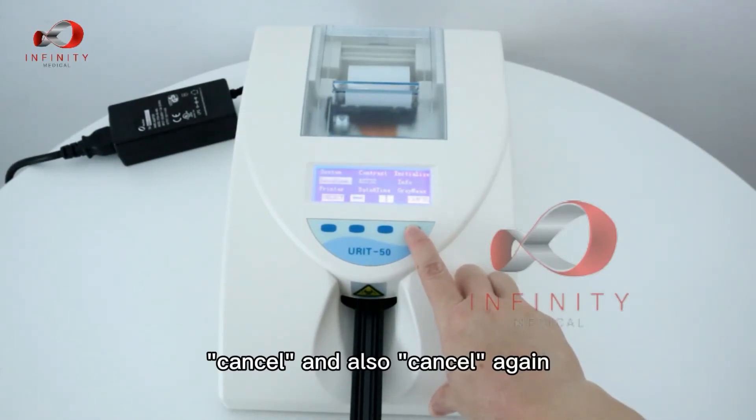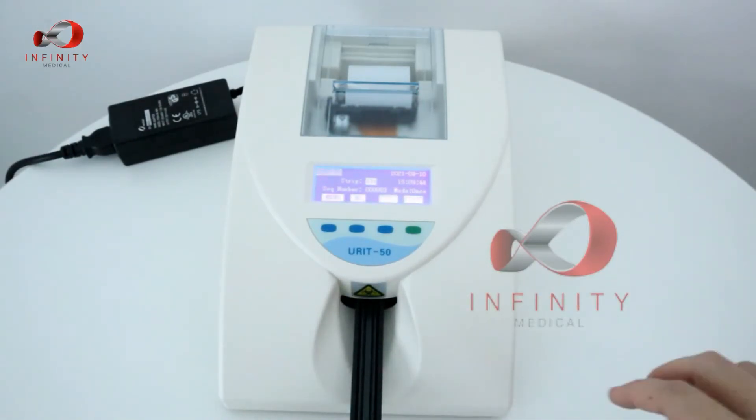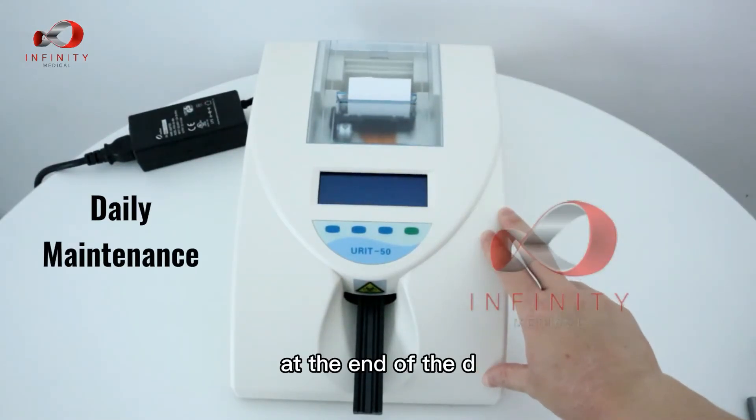Press Cancel to go back to the main menu, then Cancel again. That is the end of the test. To turn off the device, simply turn off the switch at the back.